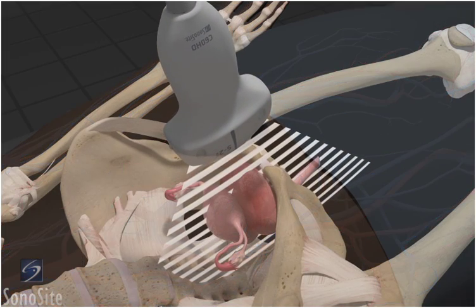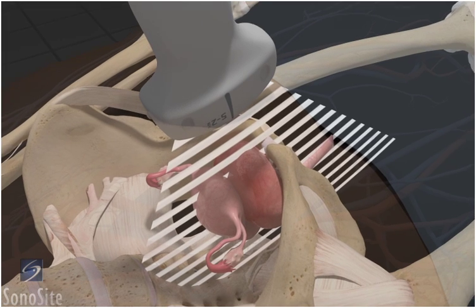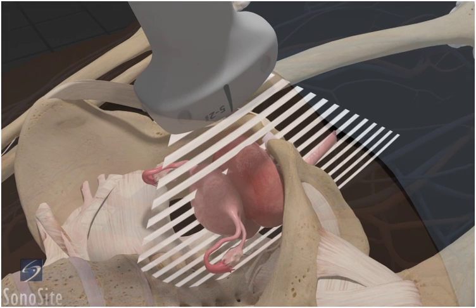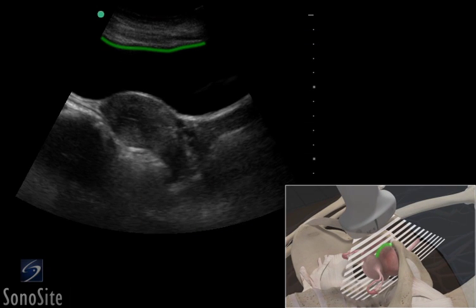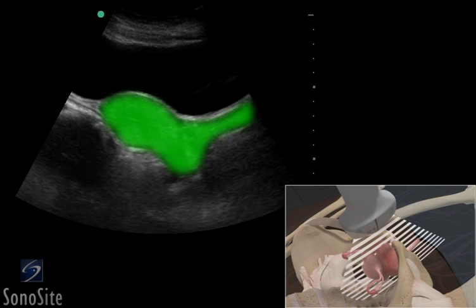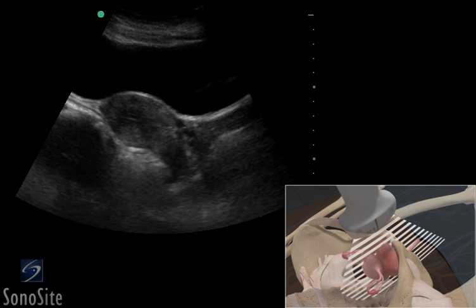Angle the transducer inferiorly into the pelvis. The bladder appears in the near field of the image as a hypoechoic triangular structure. The uterus is gray in appearance and located either directly posterior or superior to the bladder. The endometrial stripe will appear as a bright echogenic line from the fundus to the cervix.